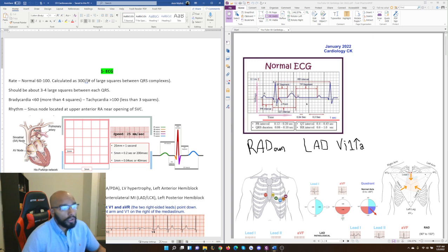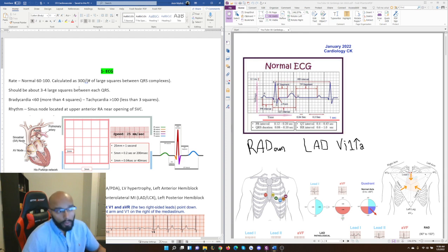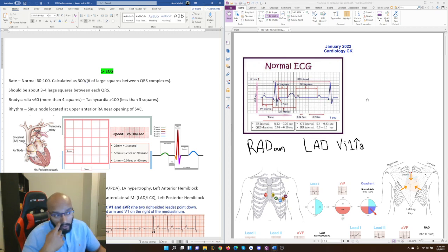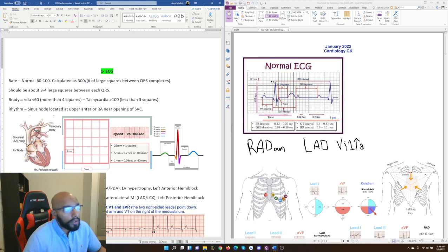The strip is showing what's happening in one second for this patient. There are about three large squares between QRS complexes here — maybe three and a half — so 300 divided by three gives 100, which is pretty much a normal heart rate. The ECG strip also shows the PR interval, QRS complex, QT interval — very significant for torsades — and the ST segment, very significant for myocardial infarctions. The RR interval is used to calculate heart rate, and the TP segment shows how long the heart takes to repolarize and prepare for the next depolarization.